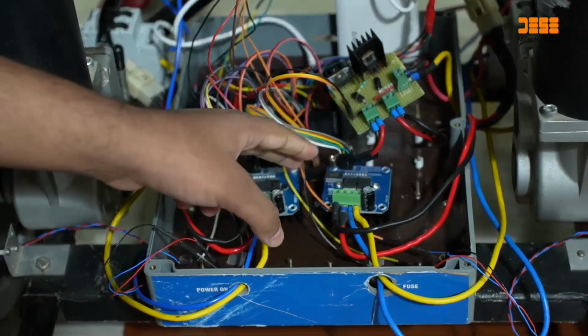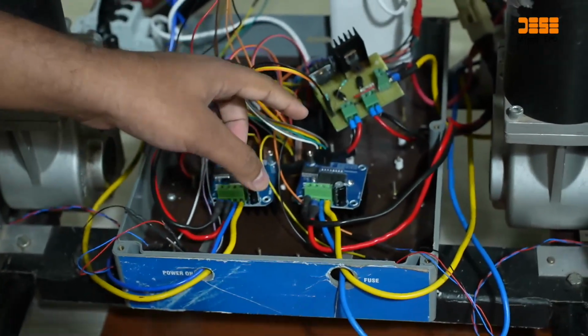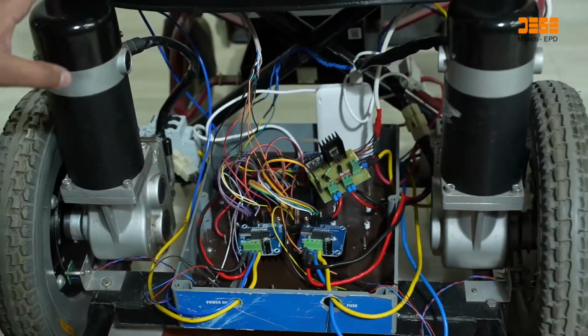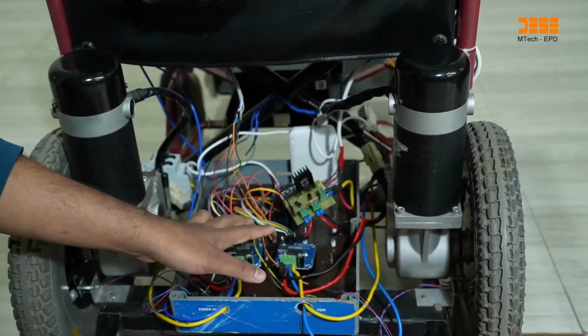So these two motor drivers are BTS 7960, and these have a power rating of continuous current of 43 amperes, and our motors are basically on full load condition are taking 13 amperes at max. So these motor drivers are integrated smoothly.